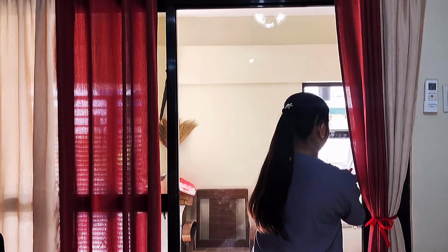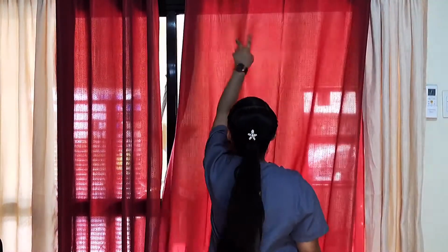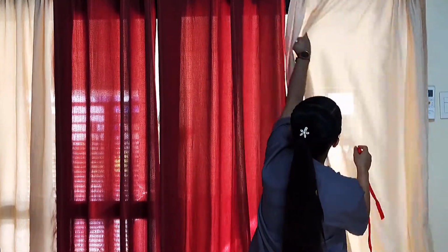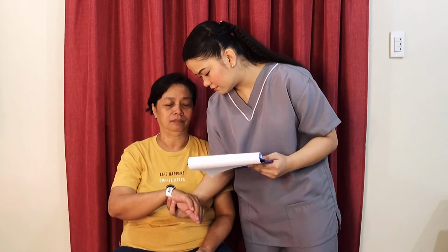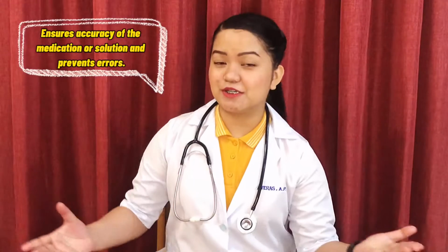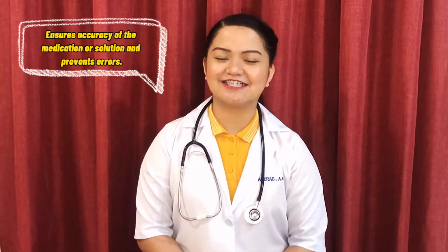And then, close the door as well as the curtains. This provides patient privacy. And then, compare MAR to patient wristband and verify this is the correct patient using two identifiers. Ensures accuracy of the medication or solution and prevents errors.